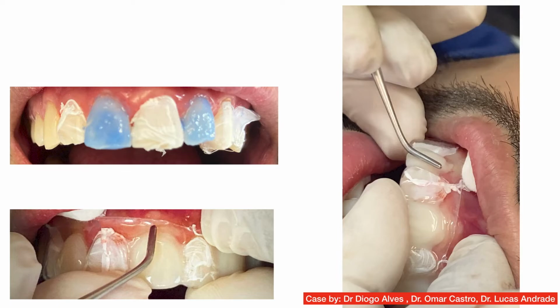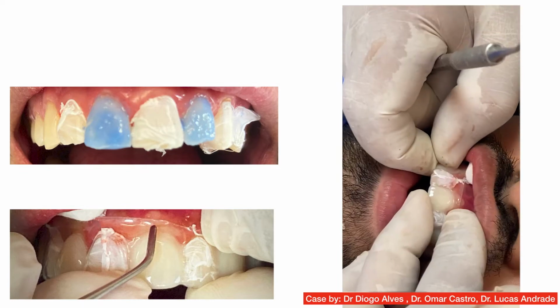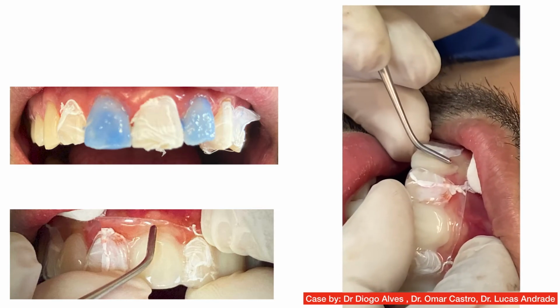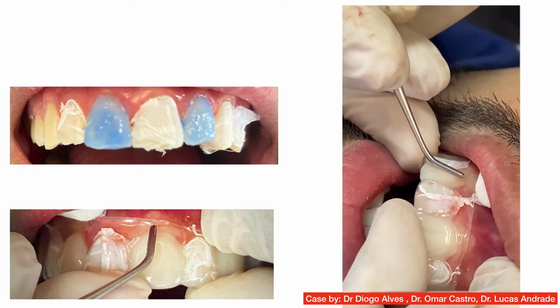The non-isolated teeth were etched, washed, adhered, and light cured. Then I injected the flowable composite shade A1 in the inside buccal area of the transparent index, and it was placed onto the patient's teeth. With that, I applied some pressure onto the resin to make sure that the buccal anatomy generated in the app was copied directly onto the resin from the model, and light cured with the index in place.